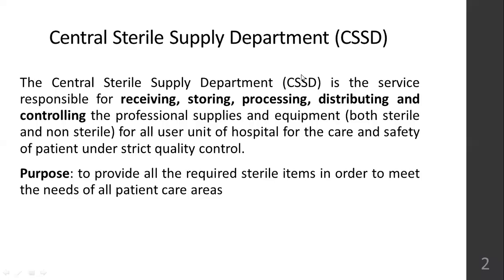So CSSD, Central Sterile Supply Department. It is a service that is responsible for receiving, storing, processing, distributing and controlling all the professional supplies and equipment, both sterile and non-sterile, for user units or clinical departments of the hospital, for the care and safety of patients under strict quality control.